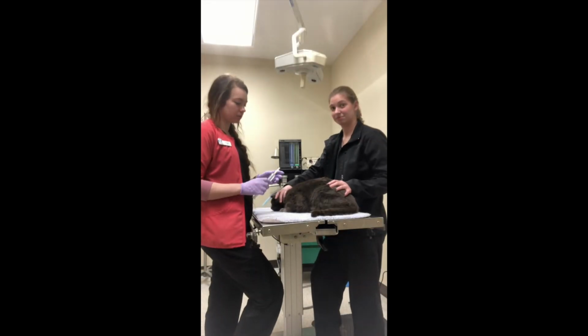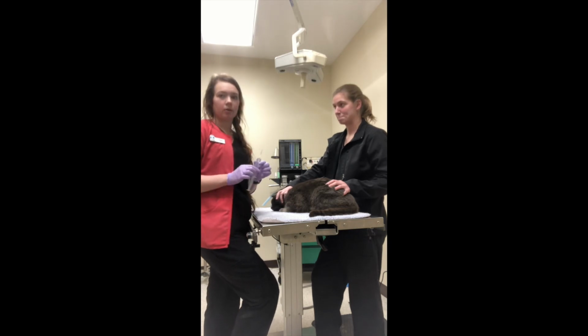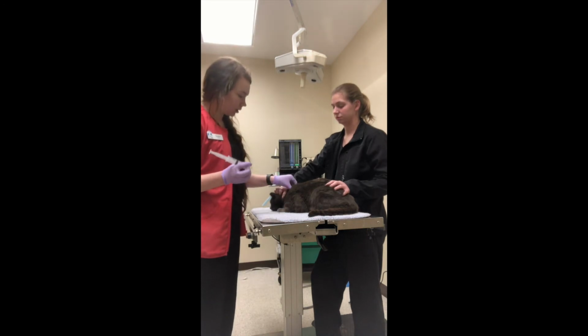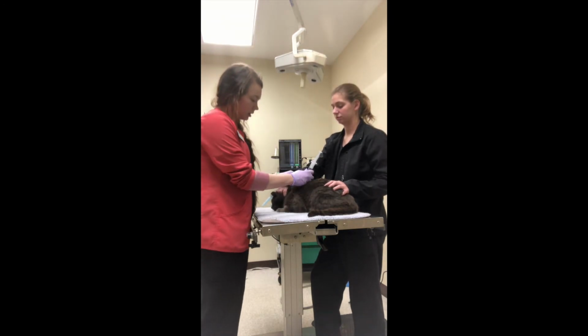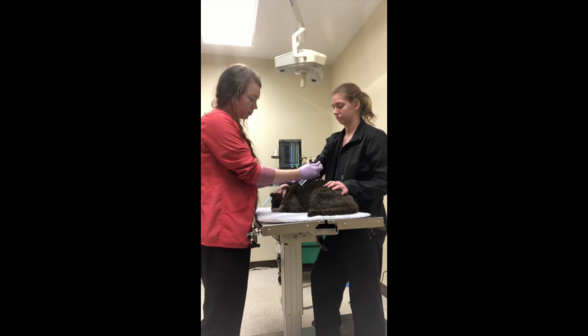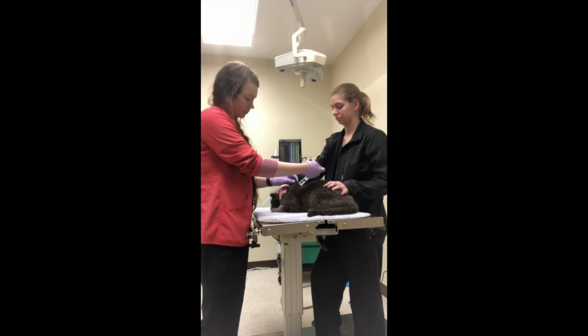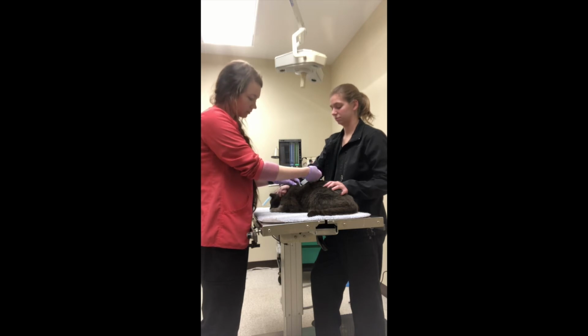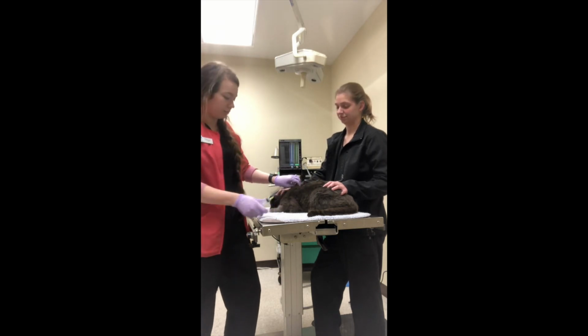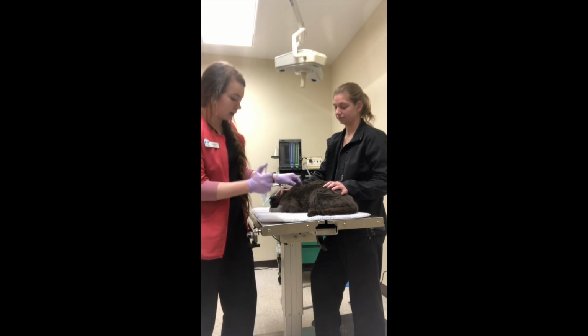Okay, I'm going to demonstrate how to give subcutaneous fluids. I have warm LRS fluids here with a sterile syringe and a sterile needle. I'm going to tent the skin above the shoulder blades and put the needle in at a 45-degree angle, being sure to not go in the muscle or in the dermis. I'm going to draw back the syringe to make sure I'm not in any vessels, and then administer the fluids. And then I'm going to pinch the skin to hold it off to make sure none of the fluids come out and that hole seals up.